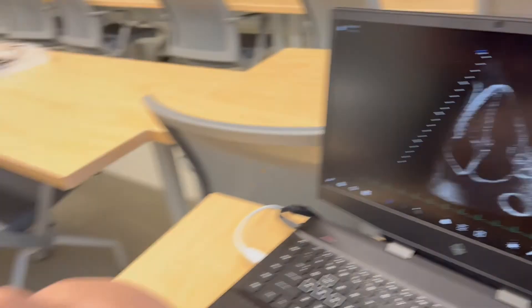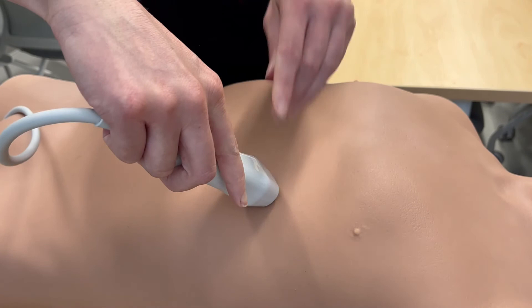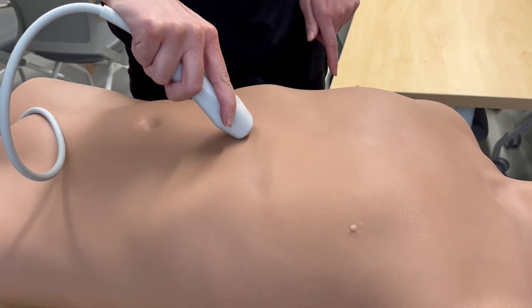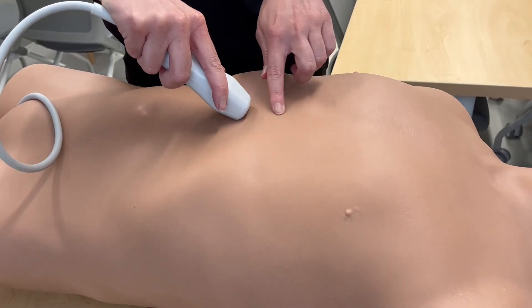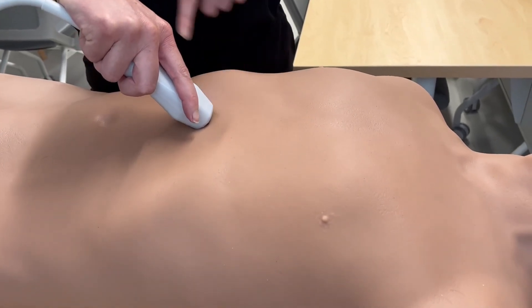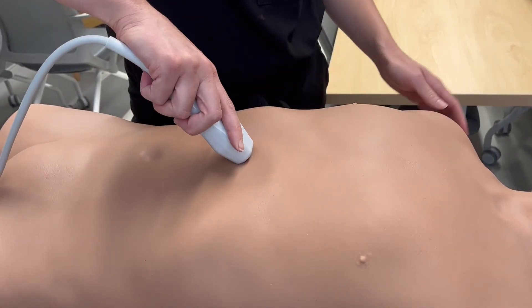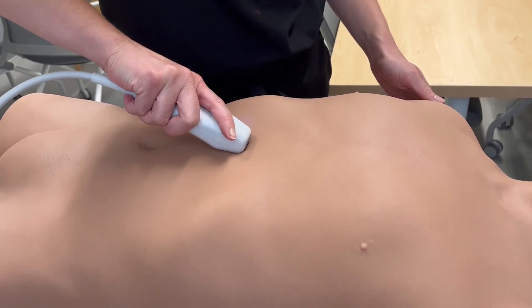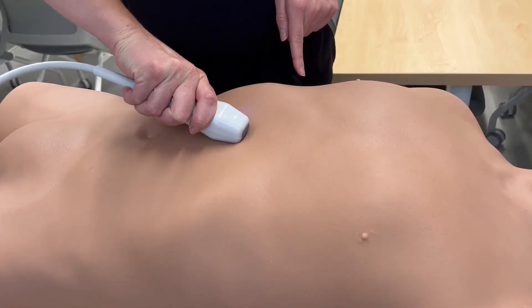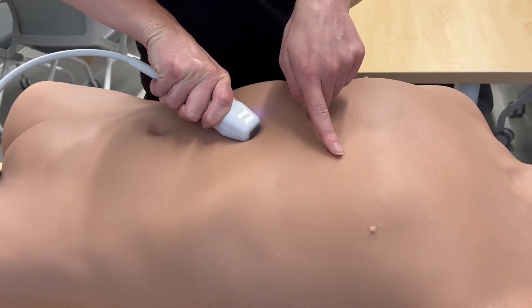The final view in our echo is the sub-xiphoid view. From the apical four-chamber probe position, we're going to keep the same orientation with the probe marker still pointed towards the patient's right, and slide the probe over to just beneath the xiphoid process. You can palpate the xiphoid process on your patient and place the probe just underneath it. You'll notice I changed my hand positioning to on top of the probe, because we need to flatten the probe to point the ultrasound up back towards the heart. You will have to press the probe down into the patient's abdomen to allow the ultrasound to see the heart.